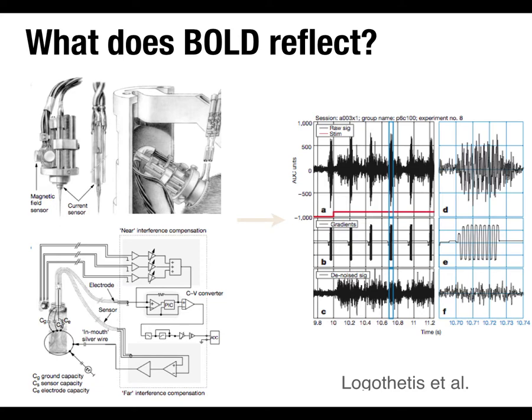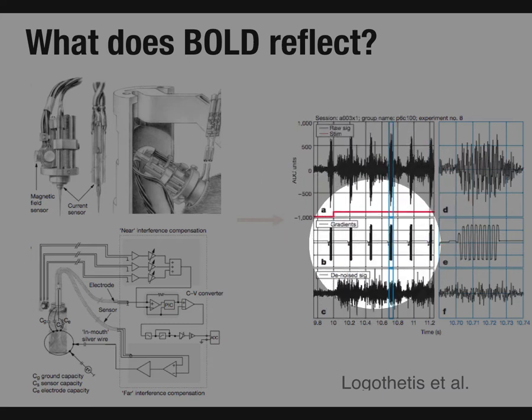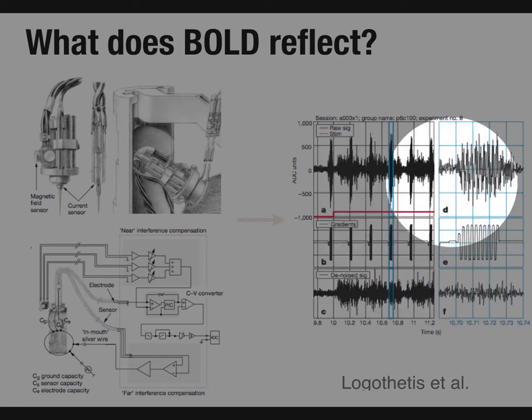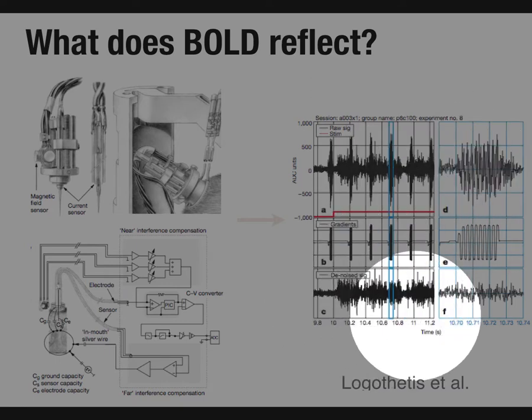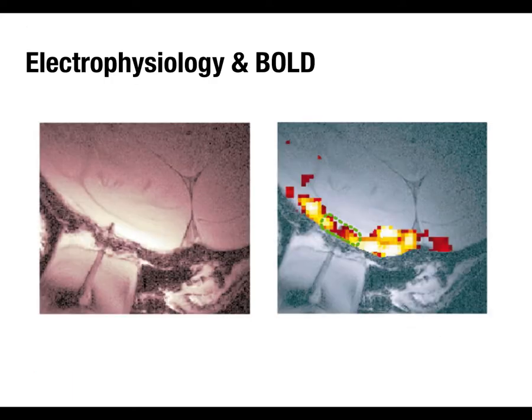Basically, this is showing you, and it's a little hard unless you can appreciate what the final signal should look like, that the raw signal is very high amplitude and dominated by these alternating spikes, which are all related to when the magnetic field gradients are on. So it's a matter of trying to measure all of that and subtract it out until you get just the residual electrical activity coming from the neurons. But they managed to do it.